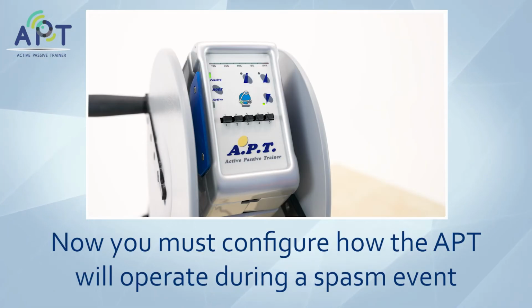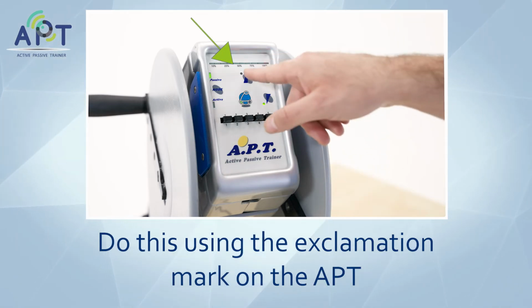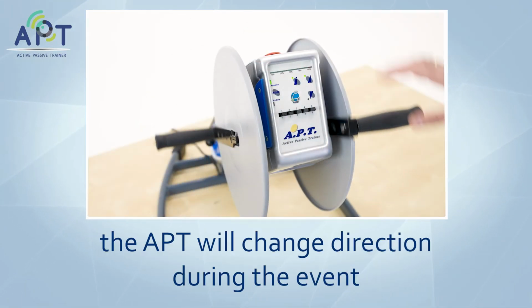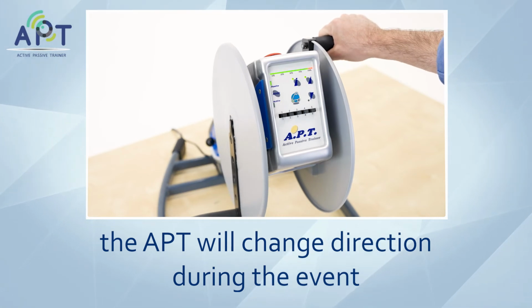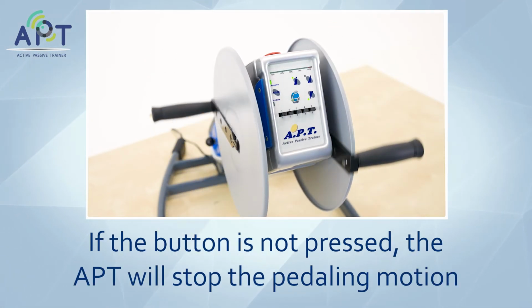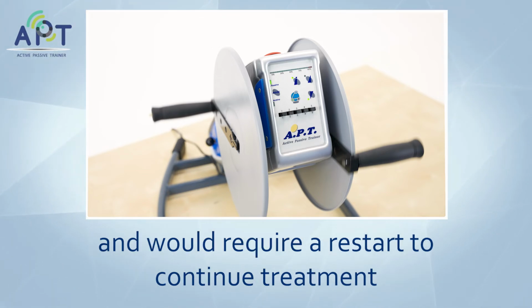Now you must configure how the A.P.T. will operate during a spasm event. Do this using the exclamation mark on the A.P.T. If the button is pressed, the A.P.T. will change direction during the event and continue motion in the opposite direction. If the button is not pressed, the A.P.T. will stop the pedaling motion and will require a restart to continue treatment.